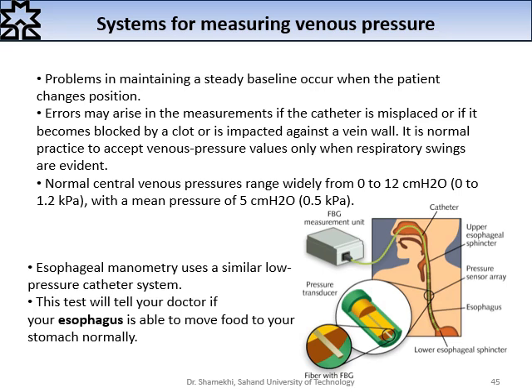Esophageal manometry uses a similar low pressure catheter system. This test will tell your doctor if your esophagus is able to move food to your stomach normally.